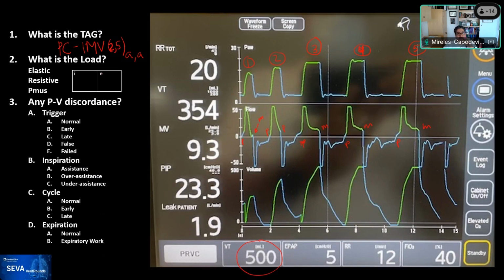And so this mode is PC-IMV type 2, meaning if all the breaths are spontaneous, they will suppress the mandatory. And type 5, in which spontaneous breaths may be converted into mandatory if the Tmin or Tmax are met, with an adaptive targeting.